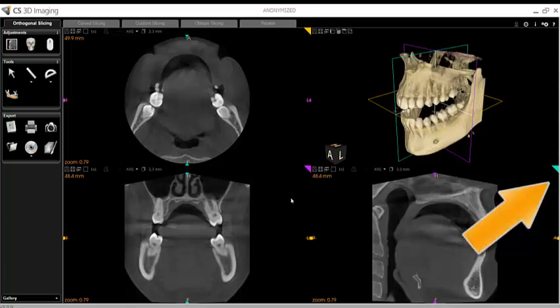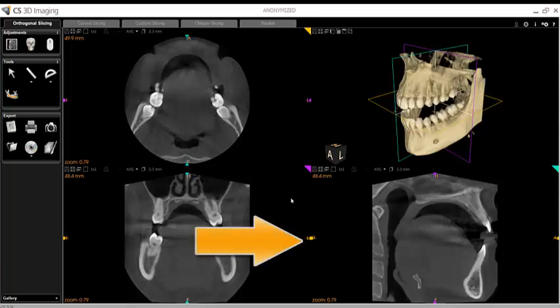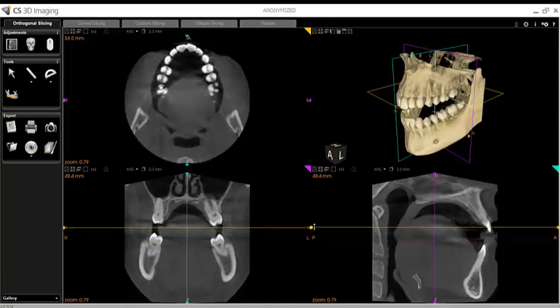The colors of these tabs correspond with the movement handles available along the sides of the different view frames. So if I wanted to move up or down, inferiorly or superiorly through the axial plane, I could simply move my mouse to the yellow movement handle, the cursor will turn into a double arrow, and then I can left-click and hold and drag the movement handle up or down.